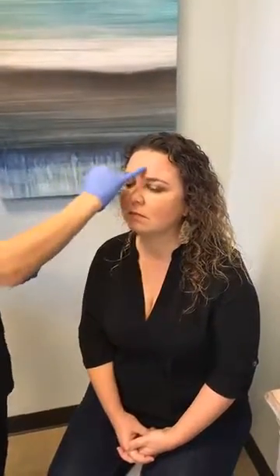Let me think what else. That's really about it. Don't massage it. Don't wear a hat or put on glasses or anything that would push it towards the eyes. It'll stay where I put it unless you push it down. And that's it. Perfect. It did not hurt at all. I didn't feel anything going in. The needle was like a little pinch and it didn't even hurt, and I have no tolerance for pain.